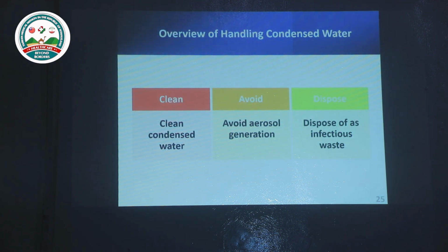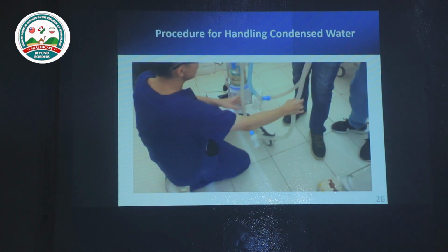Okay, and there are another 2 things I would like to supplement. The first is how to handle condensed water when a patient is using the ventilator. So we need to clean the condensed water and avoid aerosol generation, and we need to consider this condensed water as infectious waste. So we need to throw the condensed water away into the red trash can.